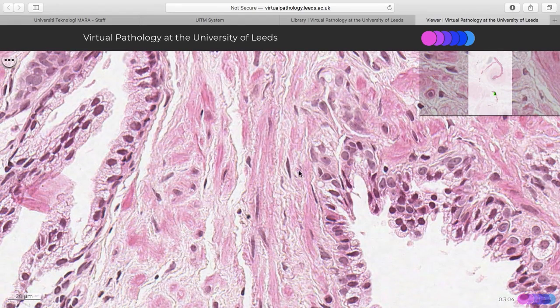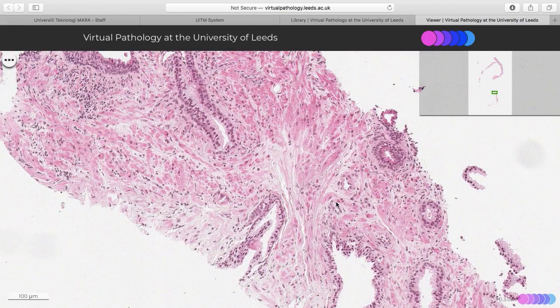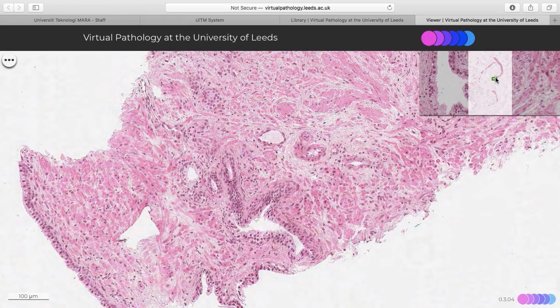That seems to be the general concept whenever you are dealing with a benign prostatic gland or prostatic tissue. Sometimes it's so obvious that even in low power you can see that there are two layers of epithelium. Now watch where my green rectangle is moving.